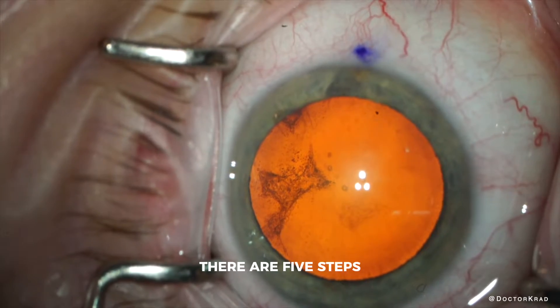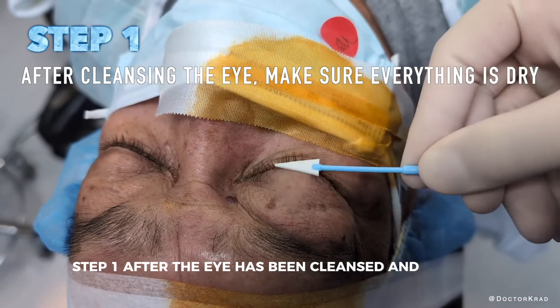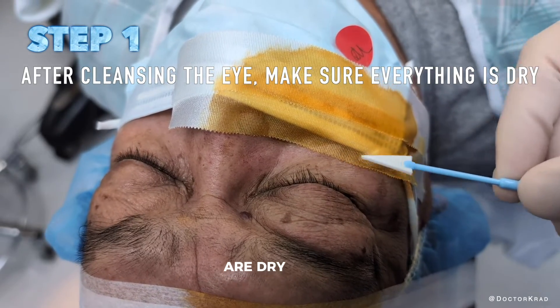There are five steps. Step one: after the eye has been cleansed and prepped with an antiseptic solution, make sure that the eyelids including the eyelashes are dry.